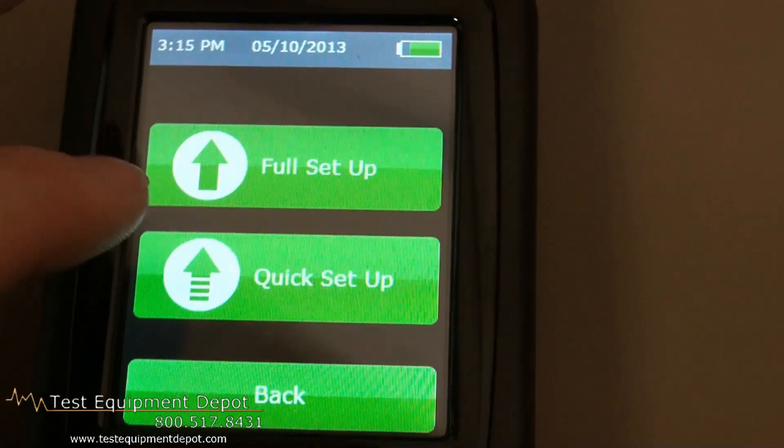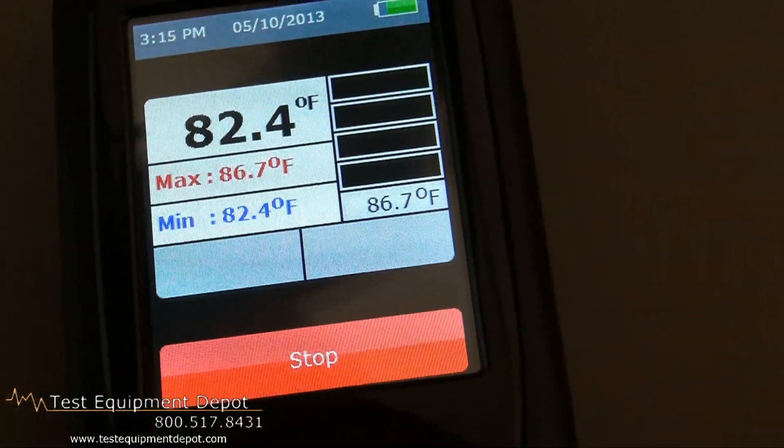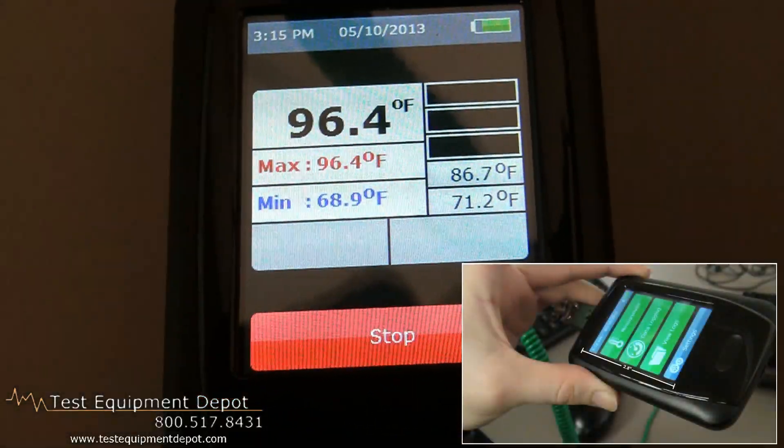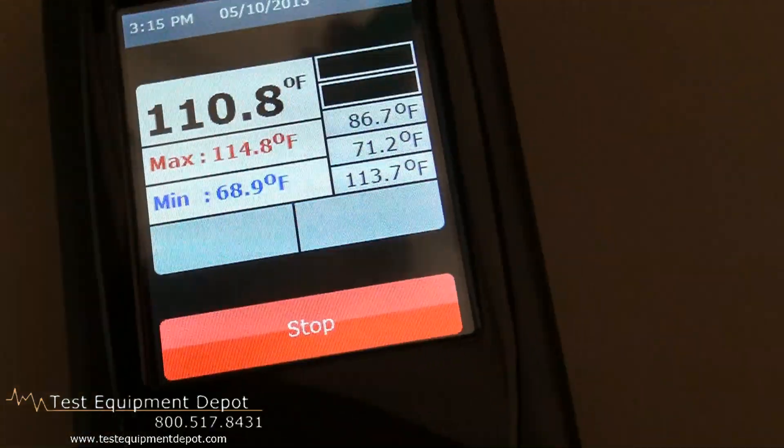It has on-screen graphing. It has two modes: logging or spot measurement. It has a 2.8-inch touch screen. It has selectable high and low alarms.